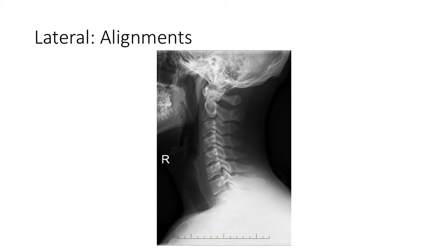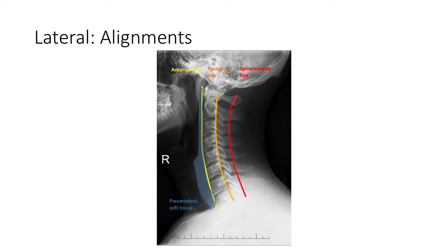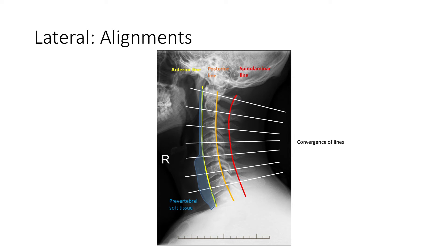For pre-vertebral tissue and alignment, we will use the five-line assessment, which consists of four longitudinal lines and the lines of convergence. The first line is the line of soft tissue. From C1 to C5, the soft tissue should be less than half of the vertebral body width. From C6 and below, the soft tissue should be less than a full vertebral body width. We also need to look at the anterior line formed by the anterior ligament, the posterior line representing the posterior ligament, and the spinal laminar line formed by the anterior edge of the spinous processes. A line should be drawn down each spinous process, which should converge posteriorly. If there is divergence, we will suspect a disruption of the posterior column.